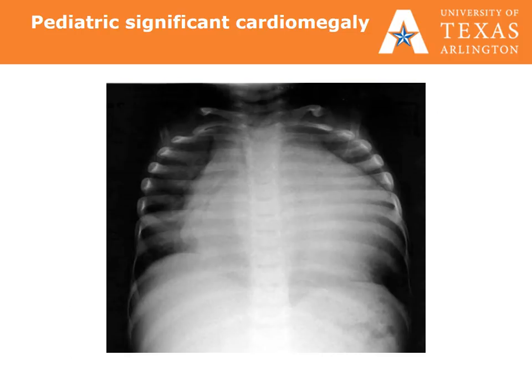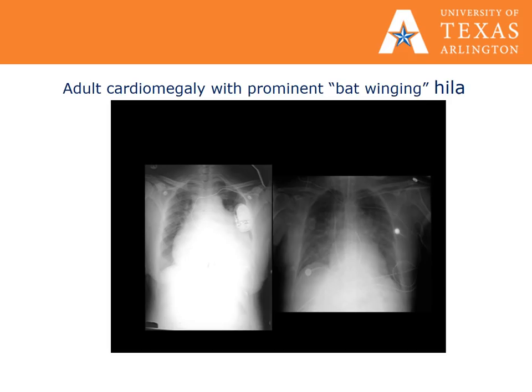Here is a picture of a pediatric X-ray with significant cardiomegaly. Here is an X-ray of an adult with cardiomegaly. Notice the prominent hila or bat-winging appearance. They also have a pacemaker placed.